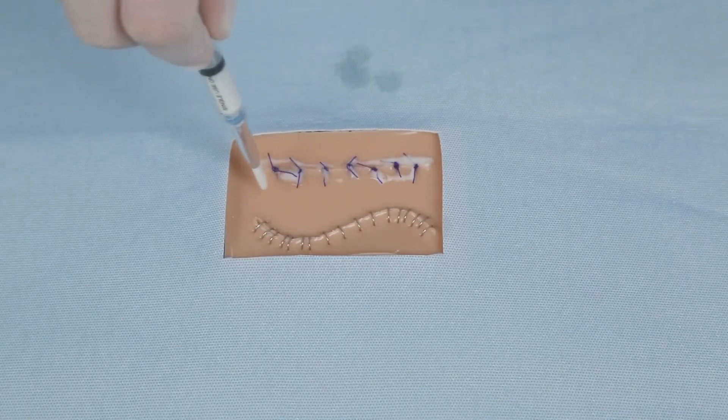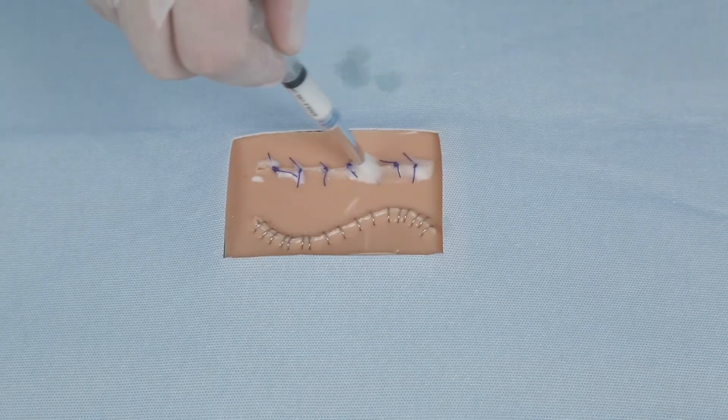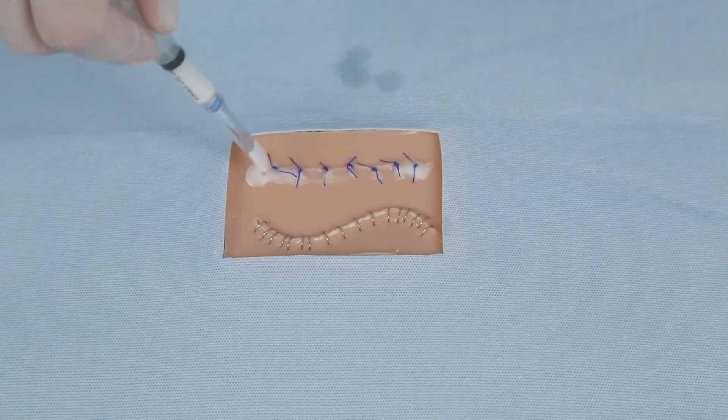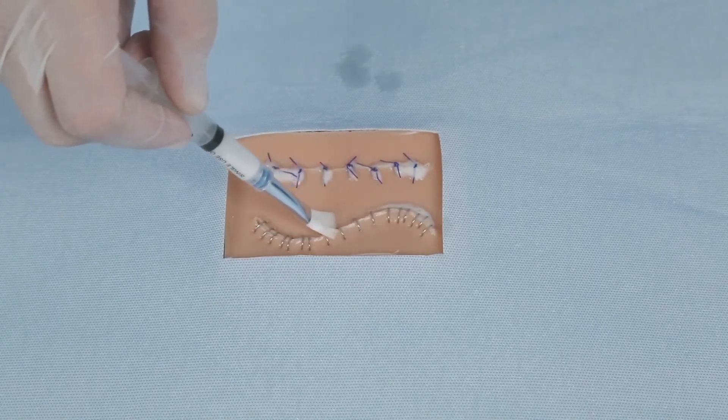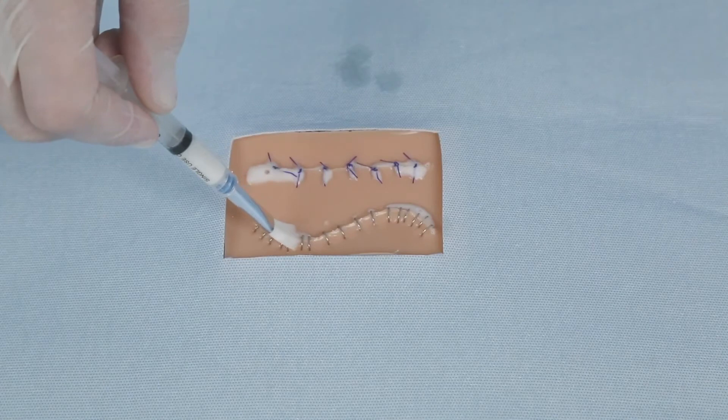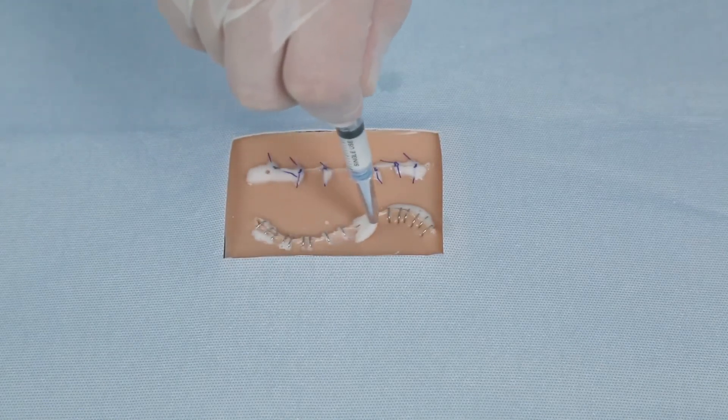Slowly push the syringe plunger until the SutureSeal polymer begins to dispense from the brush tip. Brush the SutureSeal polymer over the suture line or wound area in a thin even layer. SutureSeal is sometimes difficult to see because it is transparent or a milky white color. Runoff of excess liquid is expected.